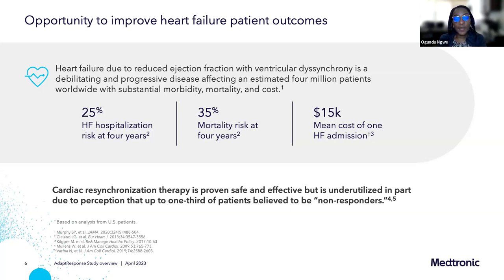Some centers actually do scheduled CRT maintenance. In essence, the patient comes in after they have their CRTD, so they can get an echocardiogram. You can look at their EKG. You can look at their clinical response, whether you do it just by asking them questions or whether they have a six-minute walk. But it's important to make sure that these patients are truly benefiting from the CRTD, so that there's truly a group that may be non-responders, but we also believe that there's a group of patients who are not maximized with respect to their CRT. Next slide.